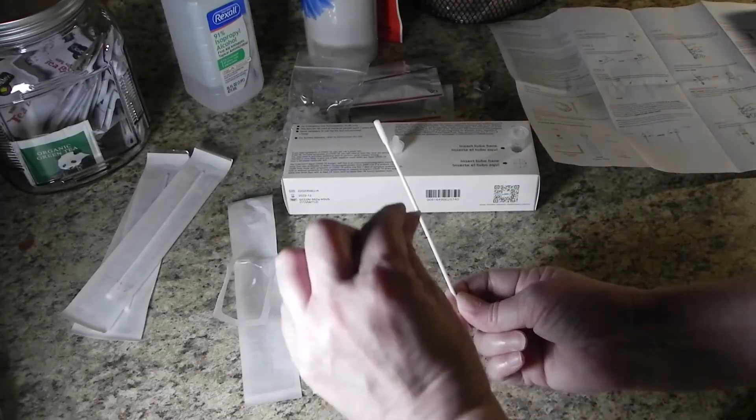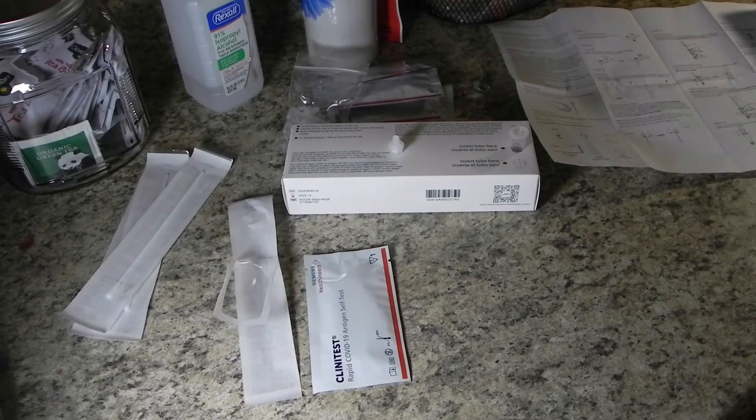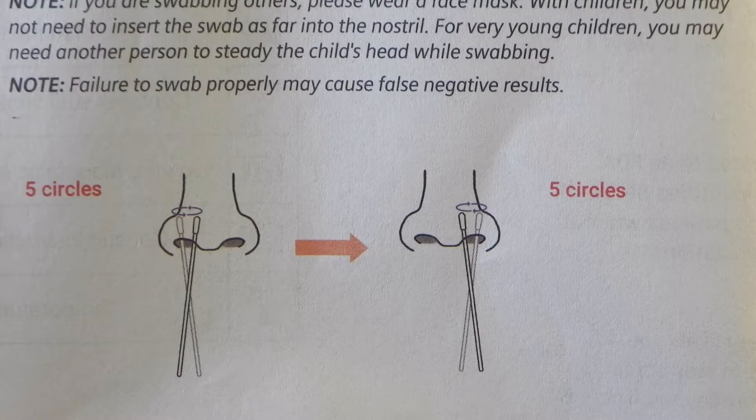Be sure not to touch the tip. Insert the Q-tip about this far into your nose — the instructions say to carefully insert the swab tip into one nostril about a half inch to three quarters of an inch deep. Once inside, swab in a circular motion at least five times and keep it in for at least 15 seconds. Then move to the other nostril and repeat, swabbing both nostrils for a total of at least 30 seconds, with at least five swabs in each nostril.